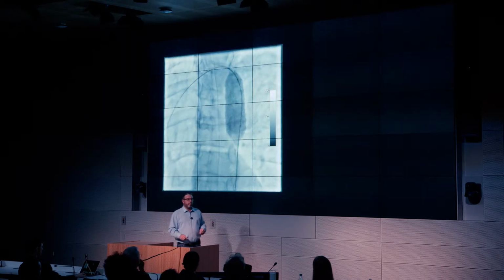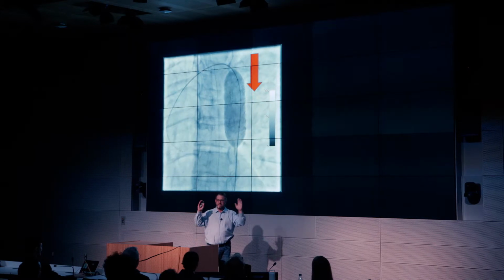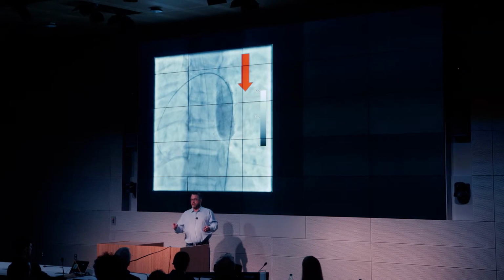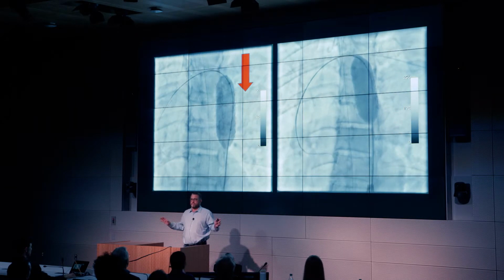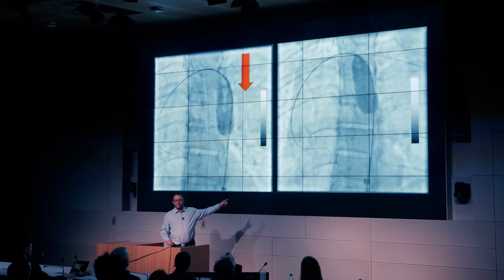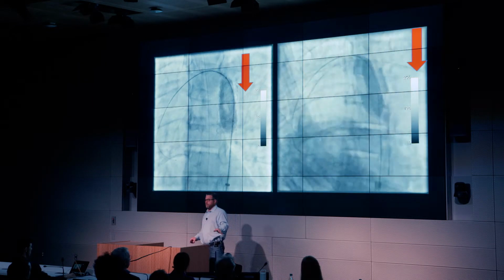This is an older patient, a girl with a similar lesion. When I blow up that balloon to dilate that stent and hold this aorta open, if you look really carefully, there's a gray blush. That gray blush is blood coming out of this little girl's aorta. This is a position I never want to be in. This aorta ruptured completely, her left chest filled up with blood. You can see us doing chest compressions and trying to patch up this aorta with this balloon, but this is an absolutely horrible situation. She has no blood pressure, the heart's not beating at all.